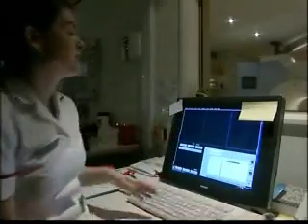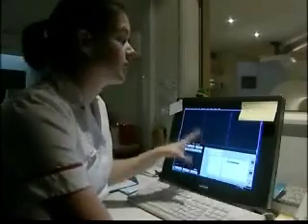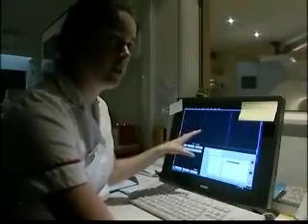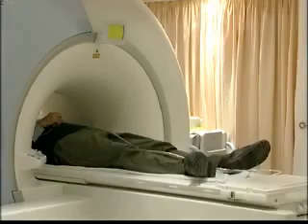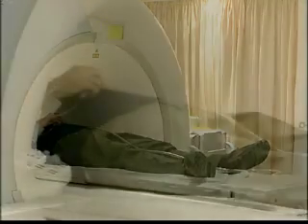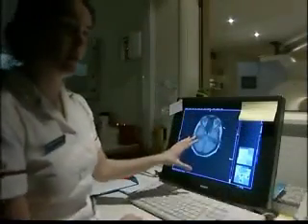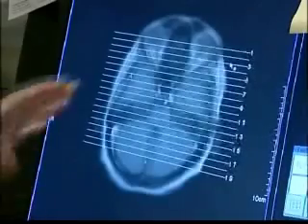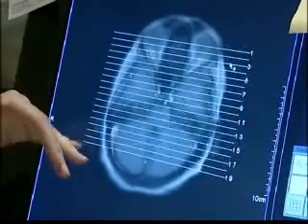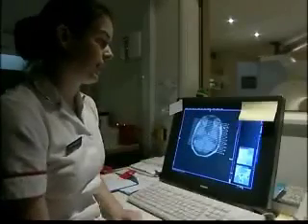So we're just going to start the scan now. What we do first is an initial pilot scan, so that's where we can exactly locate the patient within the scanner. With MRI, it's possible to choose any direction for the image slices. In this case, the radiographer is taking an axial pilot scan to give a series of coronal images.